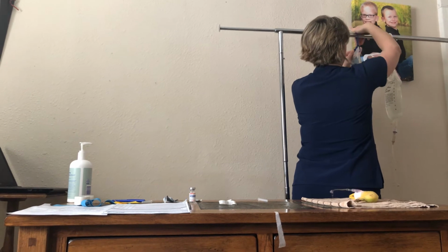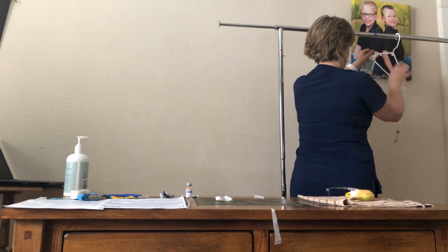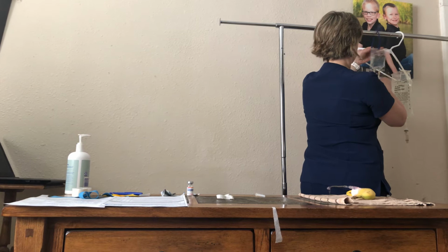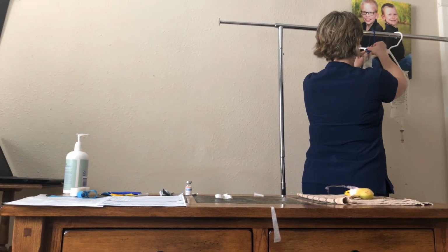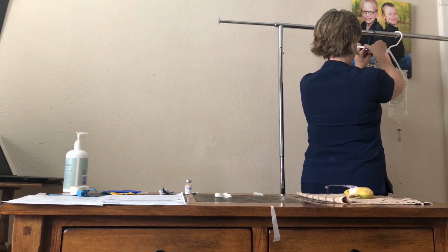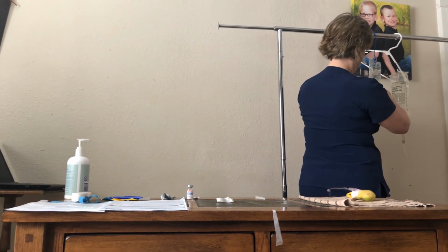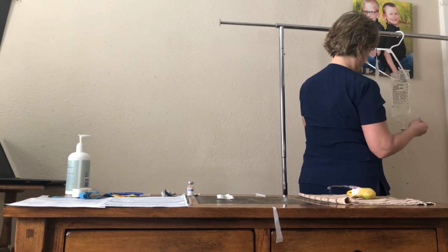And again, I'm going to hang, we don't have the best IV pole, but my IV piggyback higher than the other. Open my clamp to make sure I have no air in here.